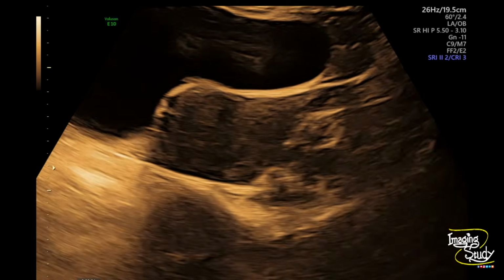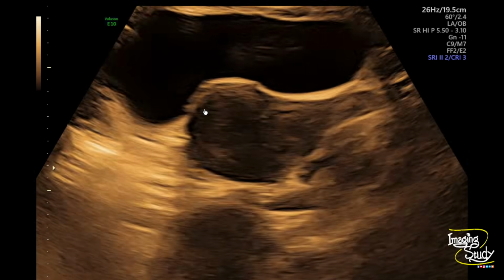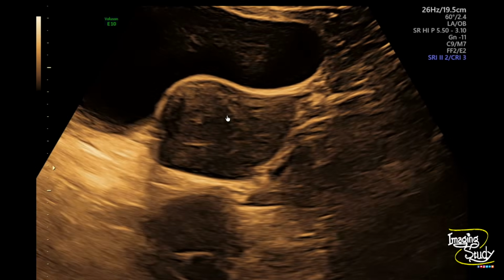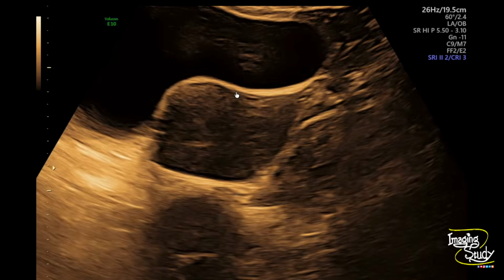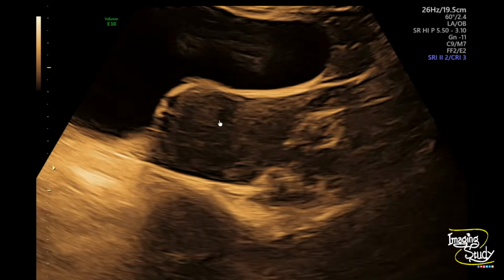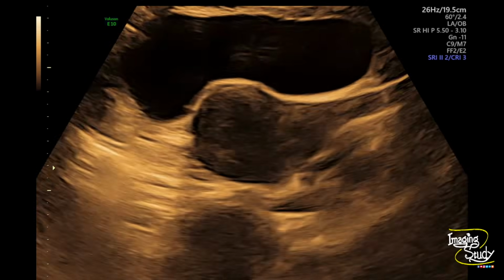Here's another view. Now you can see this pseudocapsule and this fibroid indenting the perimetrium. So it is partly subserous and partly intramural. Now to do a FIGO classification, you need to understand how much subserous or how much intramural it is. If it is more than 50% subserous, then you will go for the type 6 fibroid. If you want to say it as less than 50% subserous, then you will go for the type 5 fibroid.